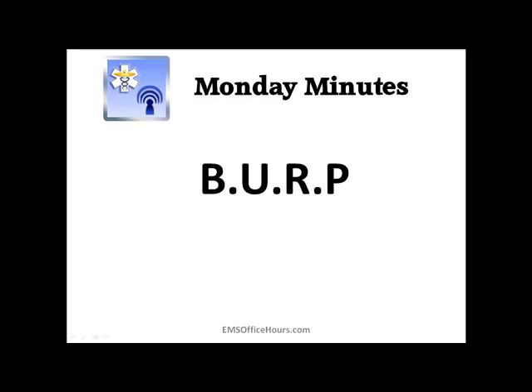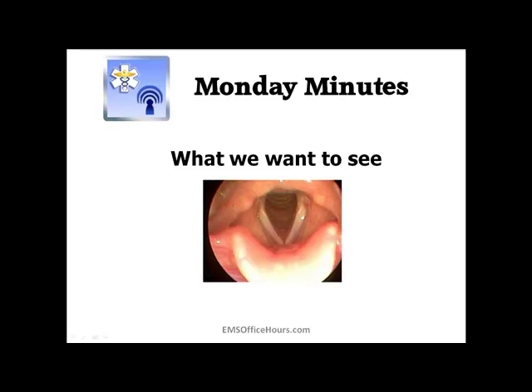Today's Monday Minutes, I wanted to just talk a little bit about a technique that you can use when you've got a difficult intubation, or maybe even a not so difficult intubation, just to further help you successfully intubate patients. Of course, in the field, what we're trained is looking for the vocal cords. And of course, we would like to see, every time we intubate somebody, a nice, clean picture of vocal cords. This is what we want to see. But of course, it's not always the case. We don't always get to have that luxury.